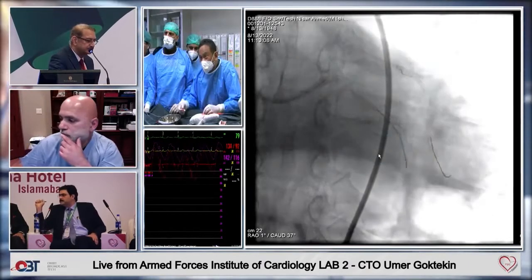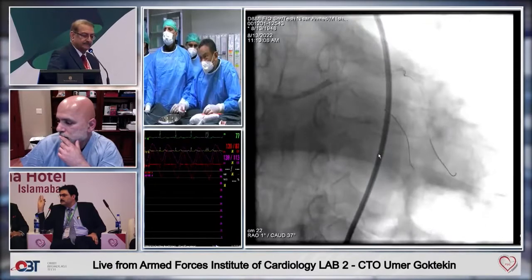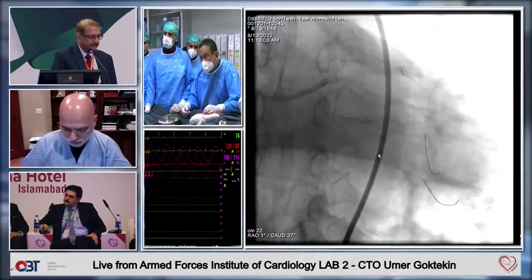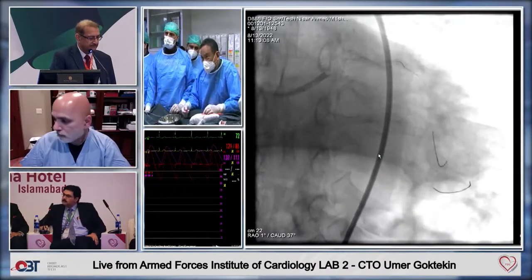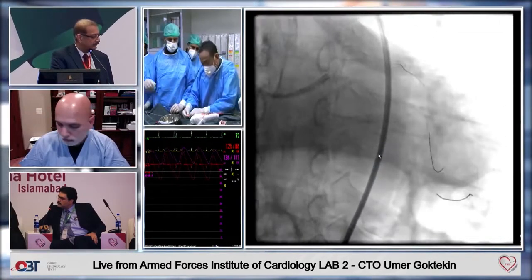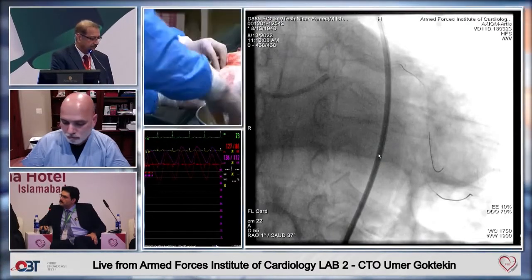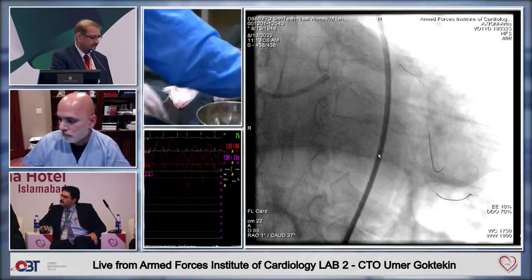So I hope to just do the ostial LAD. Again, it depends on the IVUS. If we are quite free of disease and the left main is not diseased, then yes, we'll try and see whether we can put a stent until the ostial LAD. Most of us will not do nailing of the ostium alone because there is always plaque in the distal left main. So if you try to nail that, you'll always have restenosis at the origin of the LAD, not in the circ.